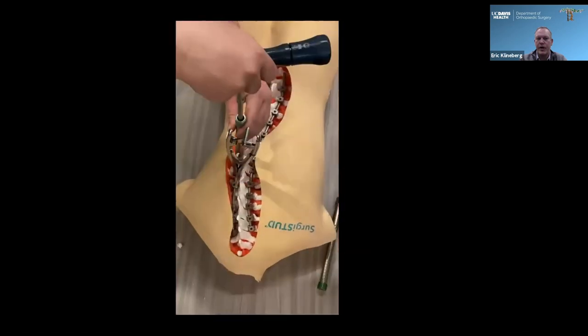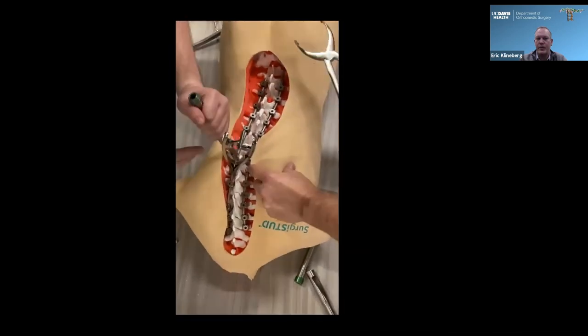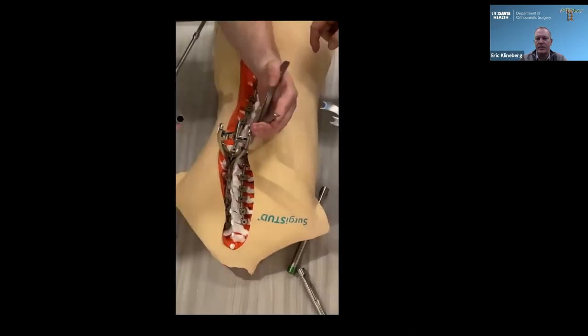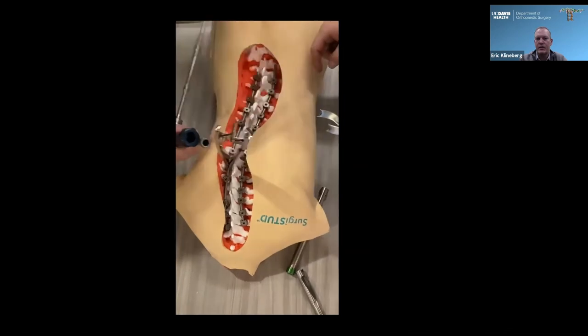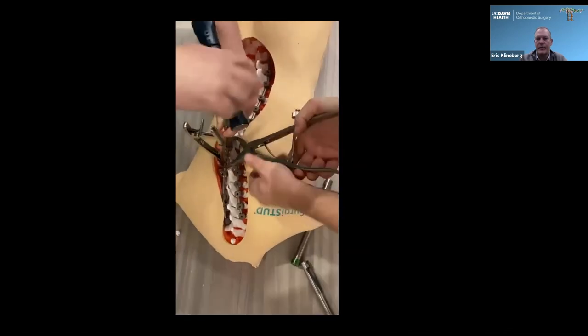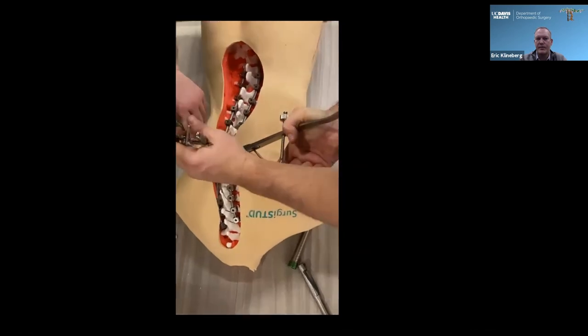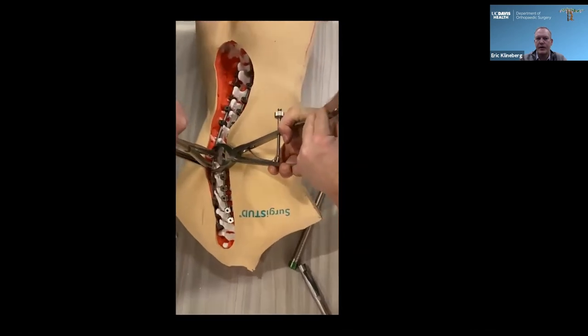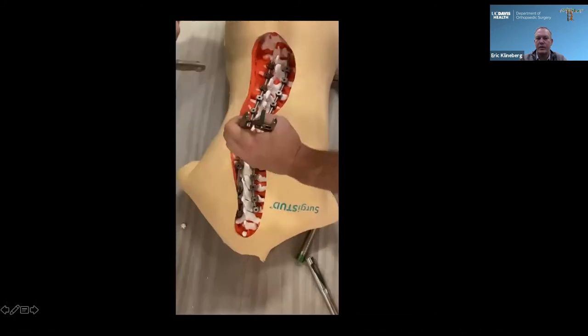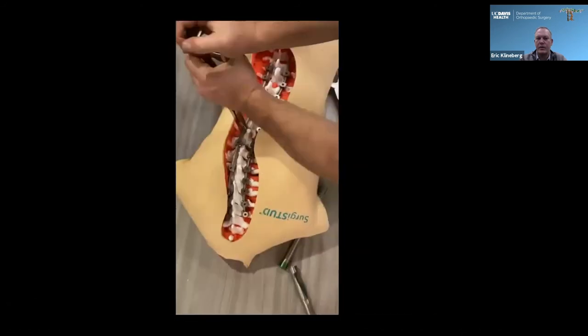And again, we try to put that rod holder so it's out of your way so you can see it, so Trevor can get over top of the screw easily. There's a little bit of bone in the way. Or plastic. Derotate, compress. And so on.